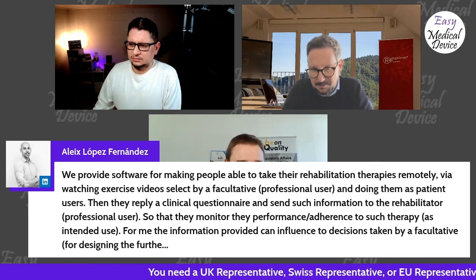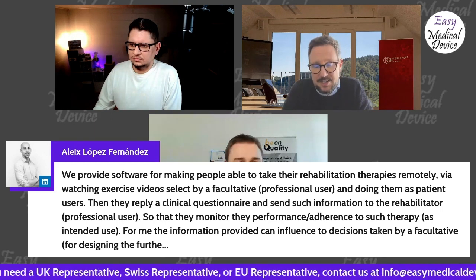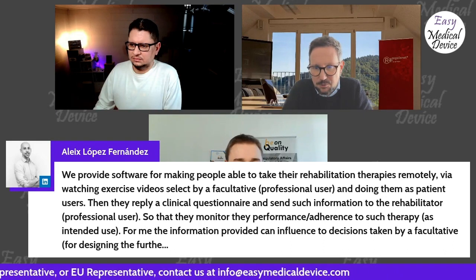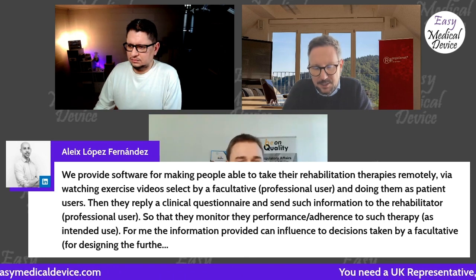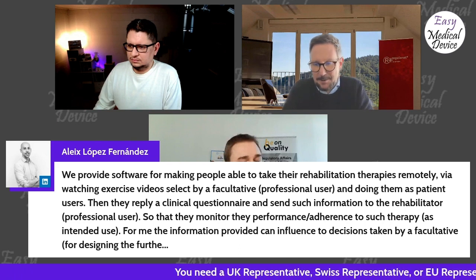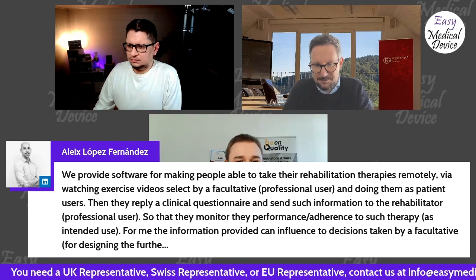Although MHRA, for example, looks differently on that if it's simple calculations. But nevertheless, under MDR, theoretically, clinical questionnaires, if they relate to scoring, so you have to do some calculations with your software, and for a medical purpose, in this case, for monitoring, then of course you're in as a medical device.